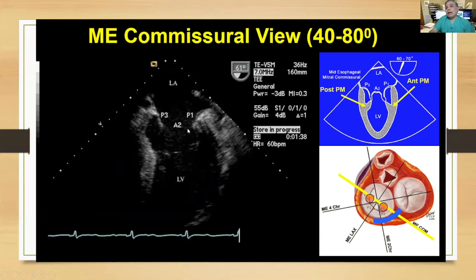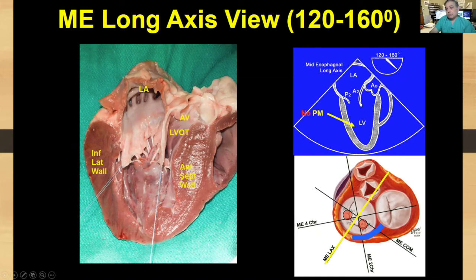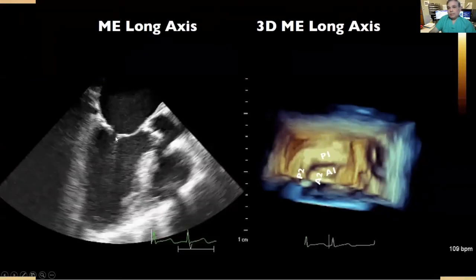Here we have an actual intercommissural view with our left atrial appendage, P1 segment, A2, and P3. From that view, we can rotate 90 degrees to get our 120-degree view, which is the long-axis view. Here we have our A2 and P2 segments, and we can take nice measurements of the leaflets. These are typically what we call our grasping view for the MitraClip. Here we can see an actual long-axis view with our anterior leaflet and posterior leaflet, which we'll use for grasping.